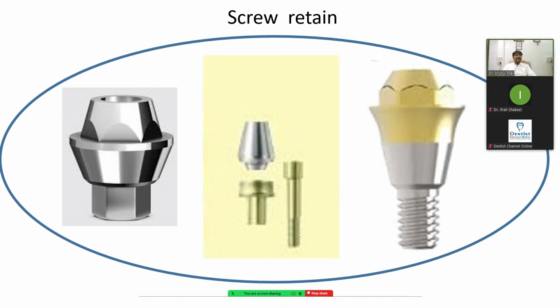So this is just an idea before starting digital, because abutment selection, the basic, is more important than doing the digital. Some doctors, some people are saying you scan it, it will give everything perfectly, no need to worry, it will fit. It is not like that. If you scan it or if you take a manual impression, both are the same, but selection of abutment is more important than doing the digital things.